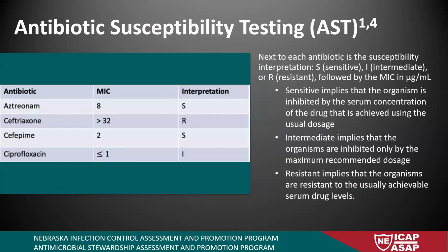I just wanted to throw this slide in here. Multi-drug resistant organism tiers for Nebraska. Who's seen this before?